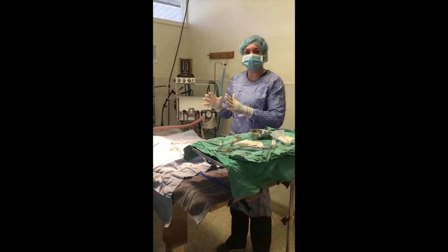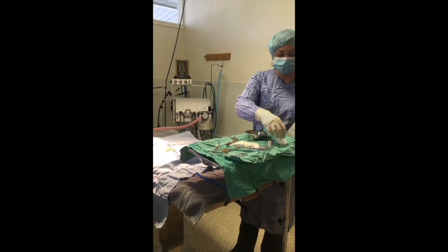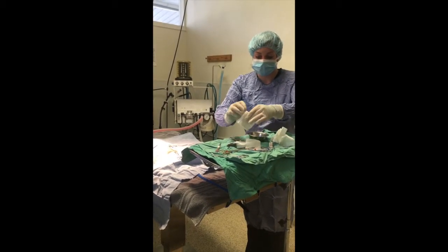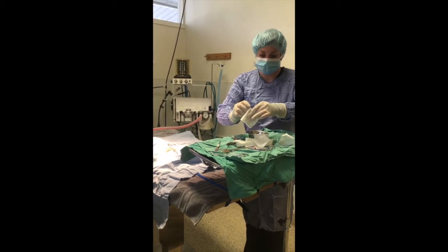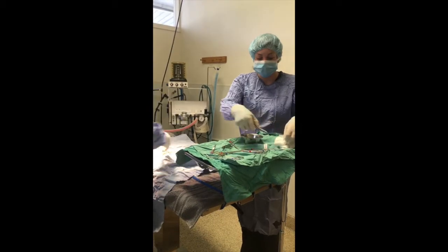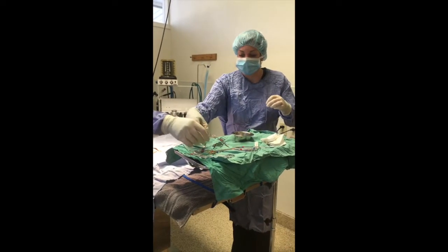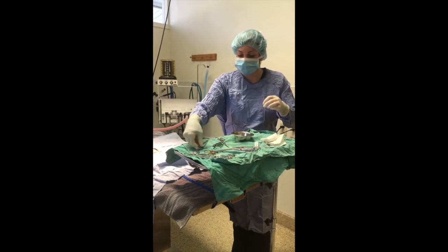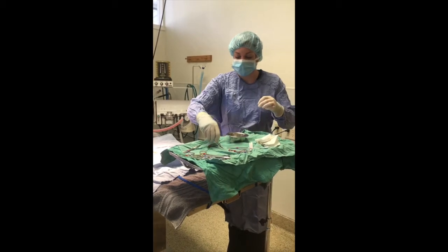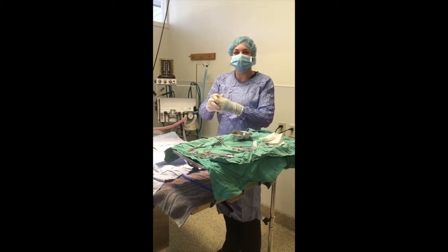On the instruments to make sure that nothing is left behind. Alright, so we have our 10 pieces of gauze. We have our 13 instruments. Everything that was used in the surgery has made it back onto the table.